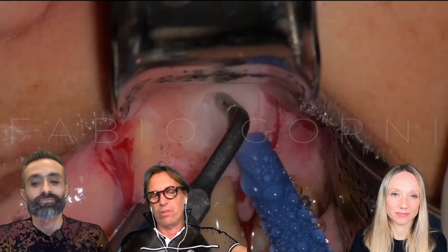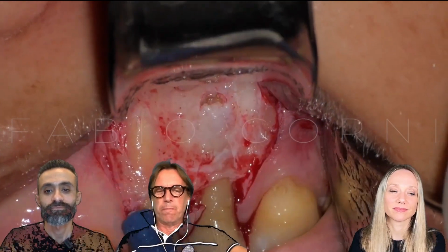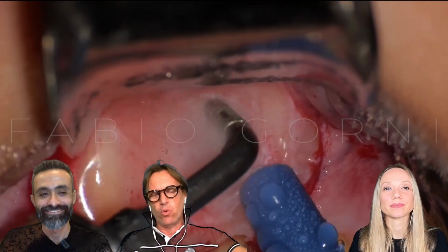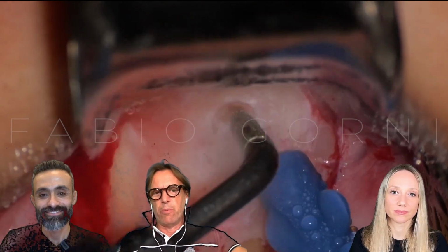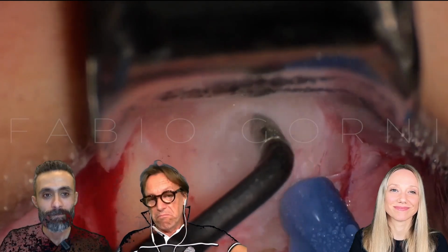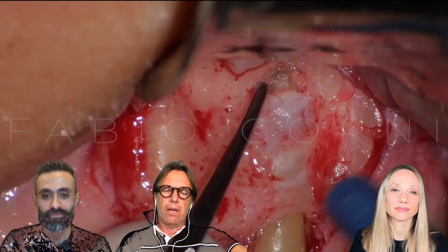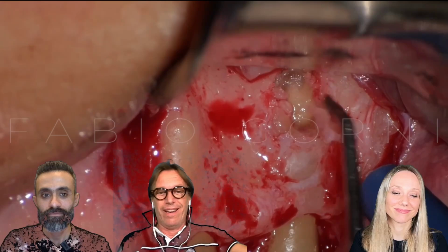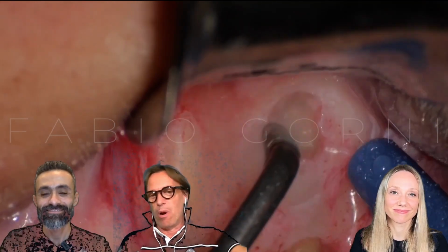It's not so difficult. I know that nowadays guided surgery is so popular, but if you use guided surgery just to get the target, it's fine. In my opinion, it is totally useless. But for beginners, maybe it can help some. But the apex is there. Like in this case, it is not a big problem.